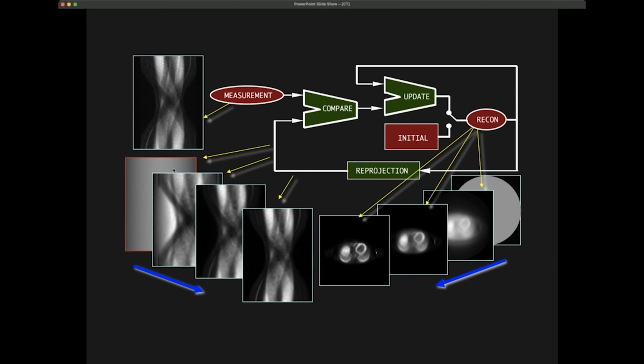And what you now can do is you can compare the two, and you can write a mathematical equation in order to update it. So saying, okay, it's so different, and everywhere it's different. So let's change this distribution, knowing that there has to be something here and this needs to be black. Let's adapt our object or our distribution, knowing how different this is.